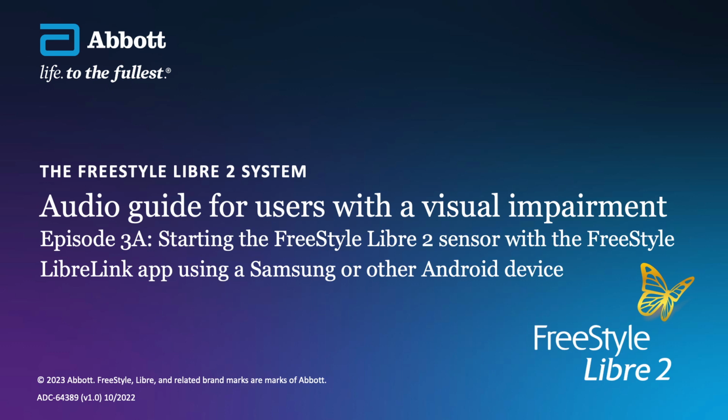Our top tip is to make sure you have turned on the app's own text-to-speech functionality, as well as the accessibility options on your phone. This is because the app functionality will interpret your scan results with important direction of travel information, which indicates whether your glucose level is rising, falling, or stable. Your usual screen reader may not read this information.